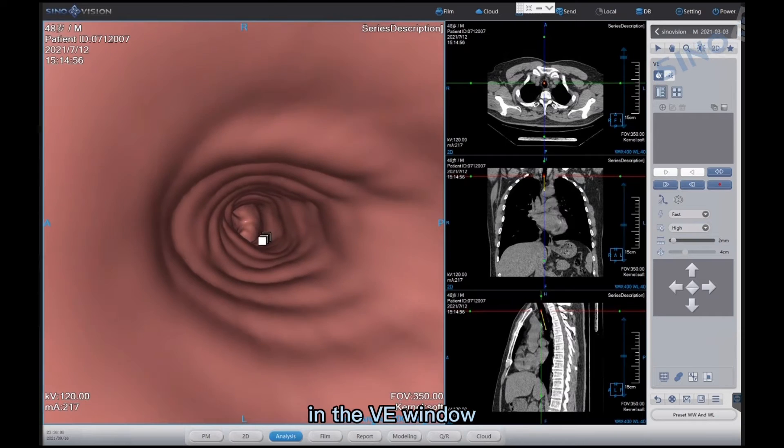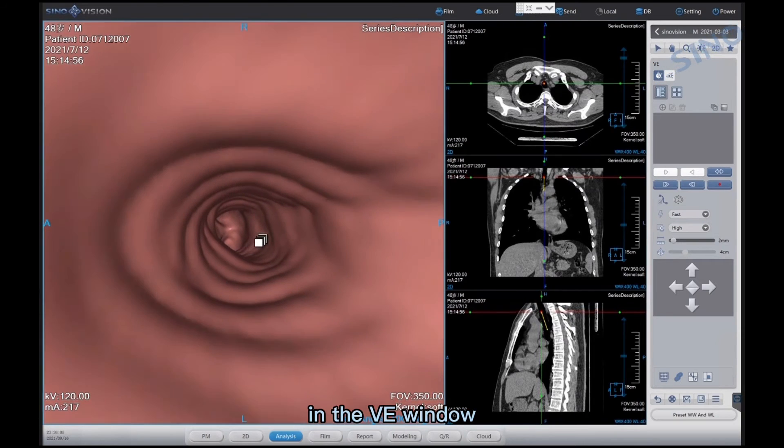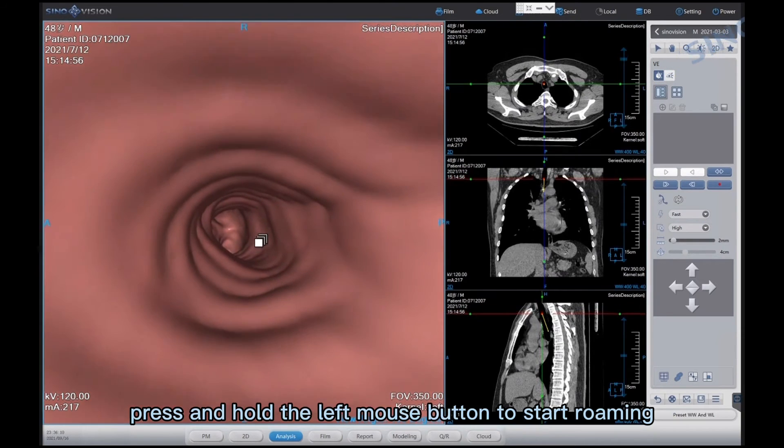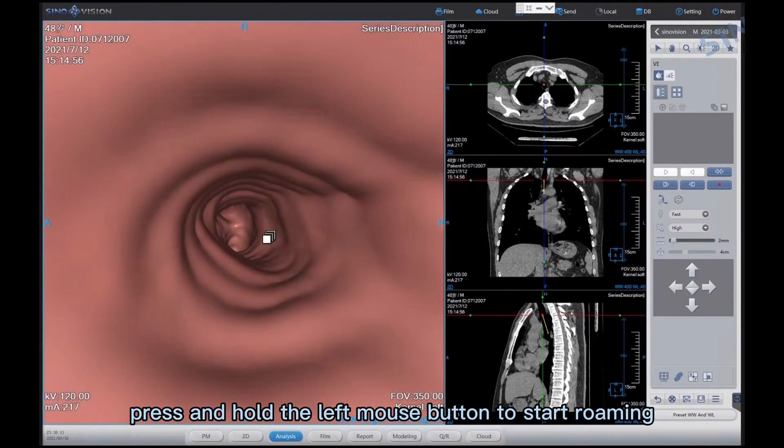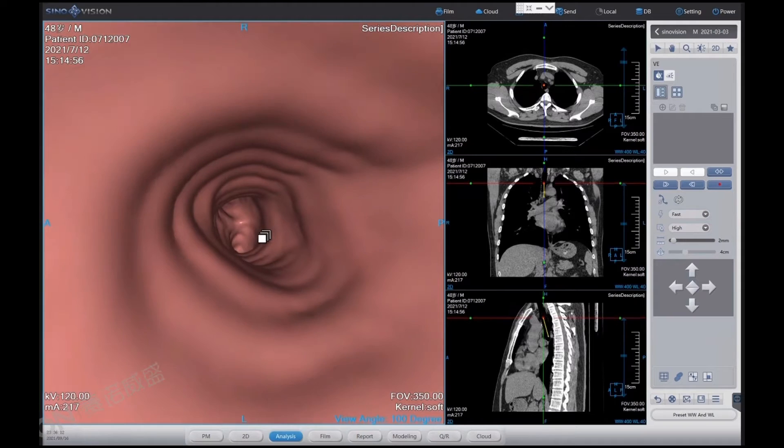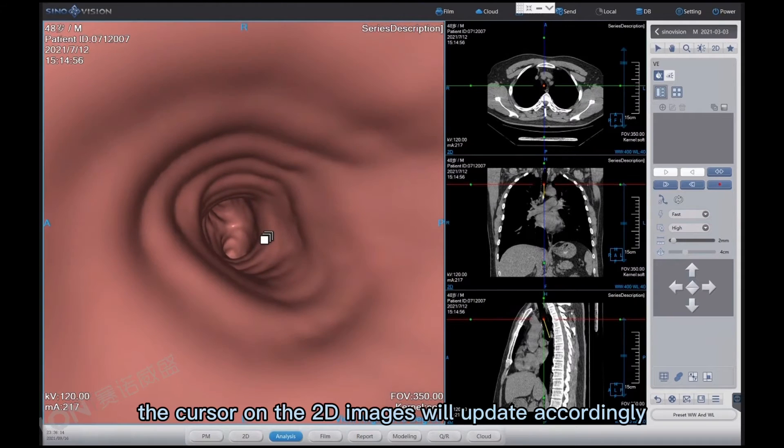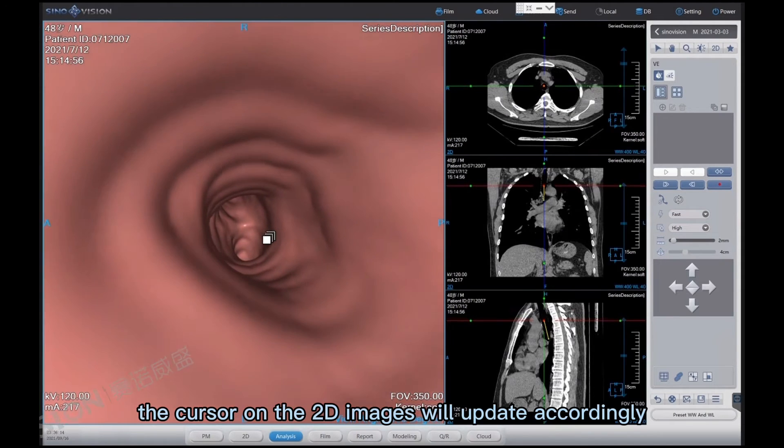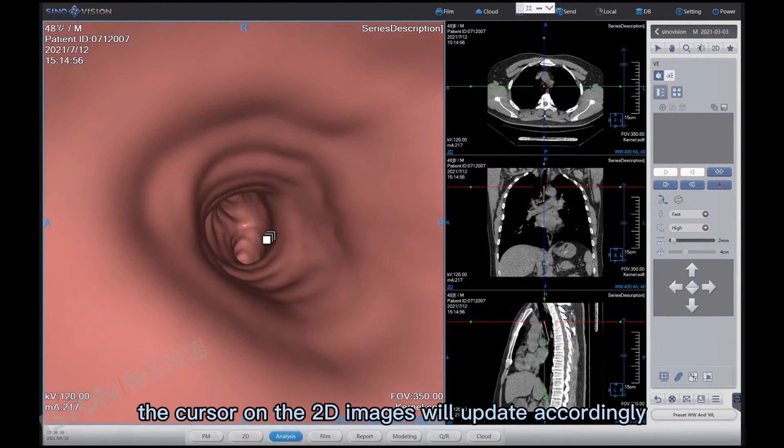In the VE window, press and hold the left mouse button to start roaming. The cursor on the 2D images will update accordingly.